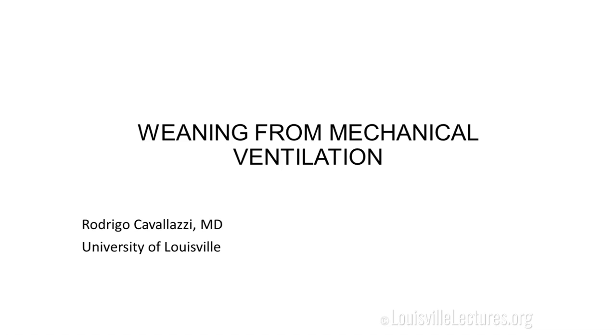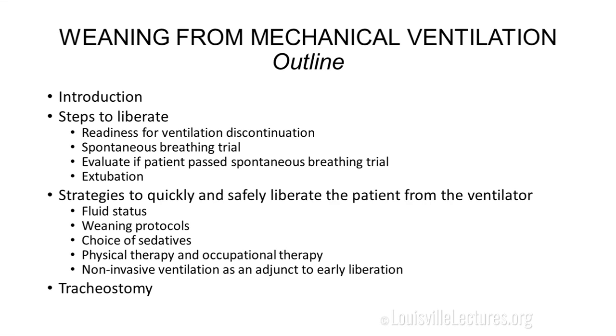So the talk today will be about weaning from mechanical ventilation. This is the outline of the talk. So we're going to talk about introduction first, steps to liberate your patient from the ventilator, and that includes readiness for ventilation discontinuation, spontaneous breathing trial, evaluate if patient passed a spontaneous breathing trial, and then the extubation itself.